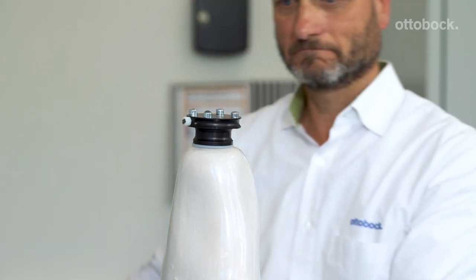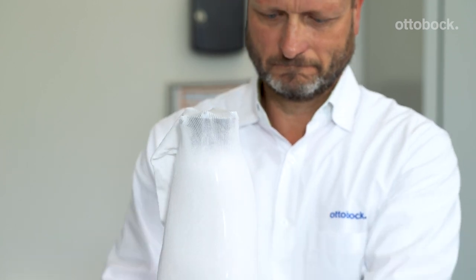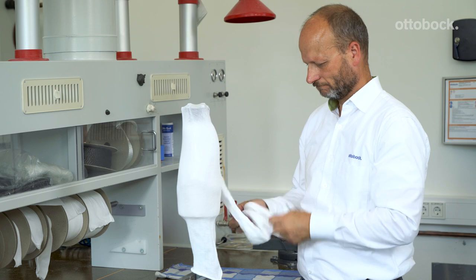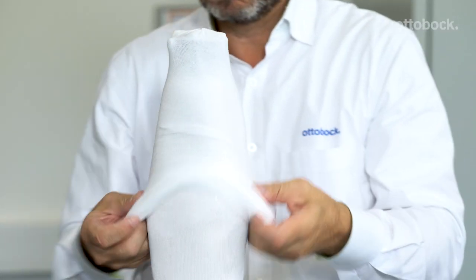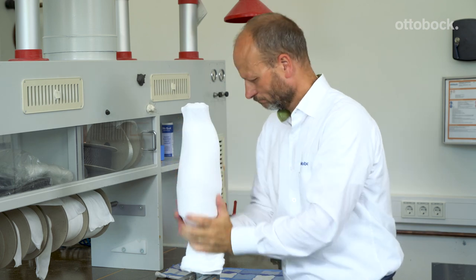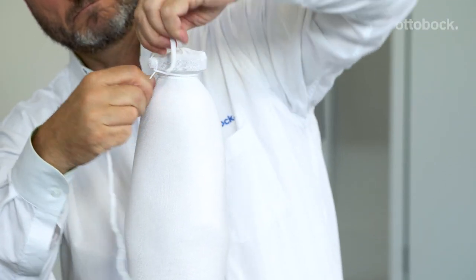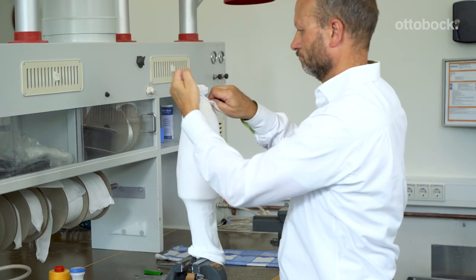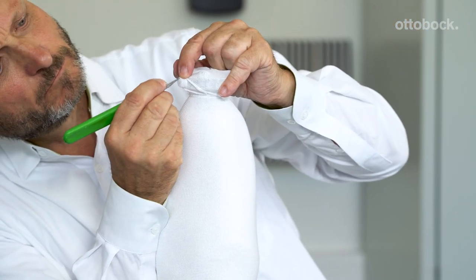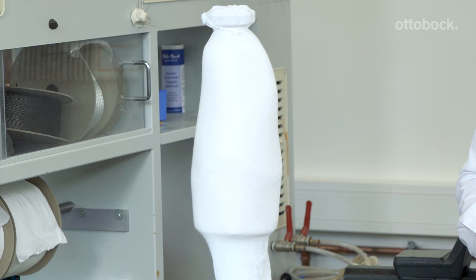Check your vacuum, then pull a double layer of Perlon stockinette over the model. Tie the stockinette off around the DVS pump, and also tie around the valve dummy and secure tightly. Expose the valve dummy using a scalpel. Now you're ready to complete the layup, including carbon fiber. Laminate per the IFU or use your personal layup to finish the DVS socket.